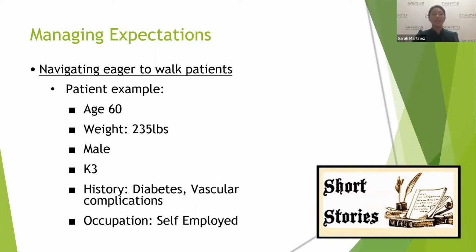So the patient's volume had changed, and the modifications that I did to the socket were too much. So it was just too tight. So I go back to the lab and I put some heat on this, and I tried pulling out the plastic. The nice thing about using this plastic material is that it's heat moldable. So in circumstances like this, we can apply some heat to this material and then pull it out to allow the patient to go further down into the socket. Although it helped, it didn't solve the problem that we were facing.